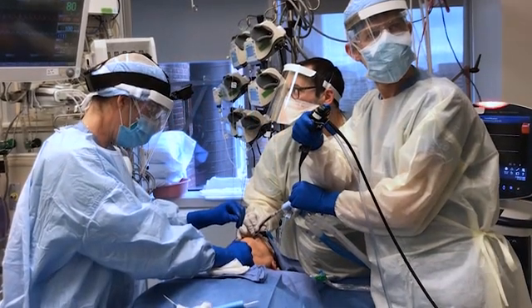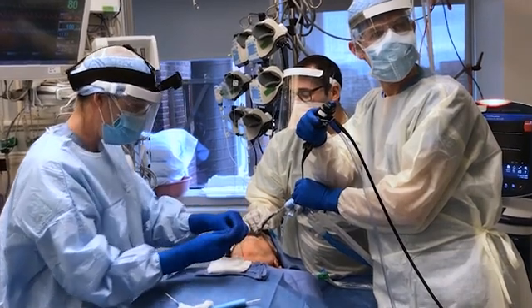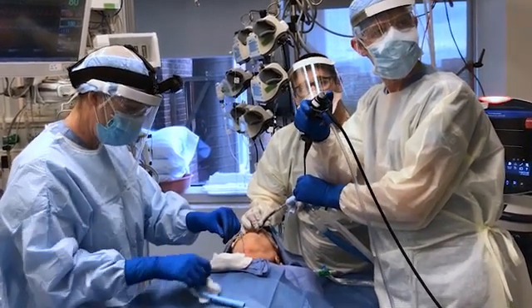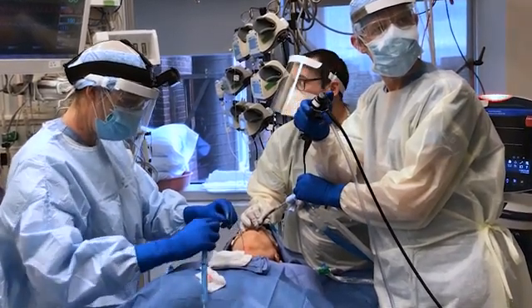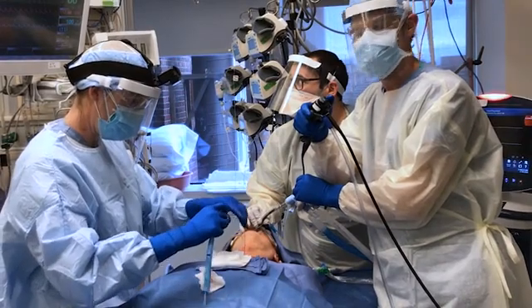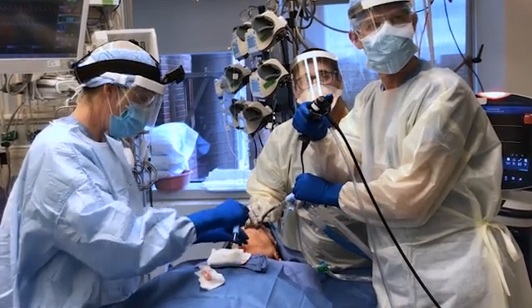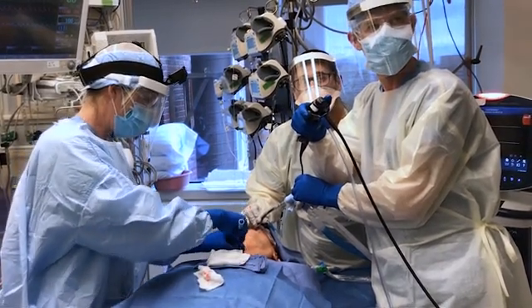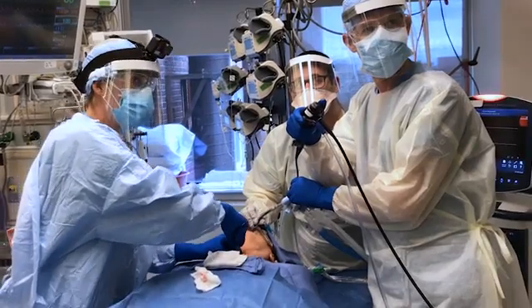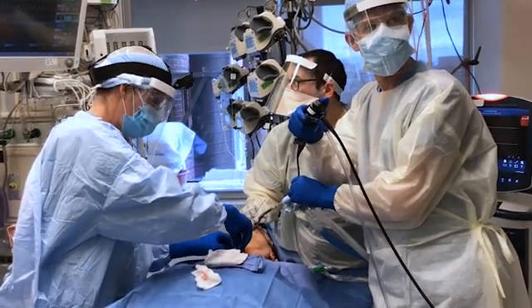The percutaneous technique can be performed quickly and safely at the bedside with the use of a modified Seldinger technique and bronchoscopic guidance. This approach is associated with fewer bleeding complications than open tracheostomy and similar long-term morbidity.